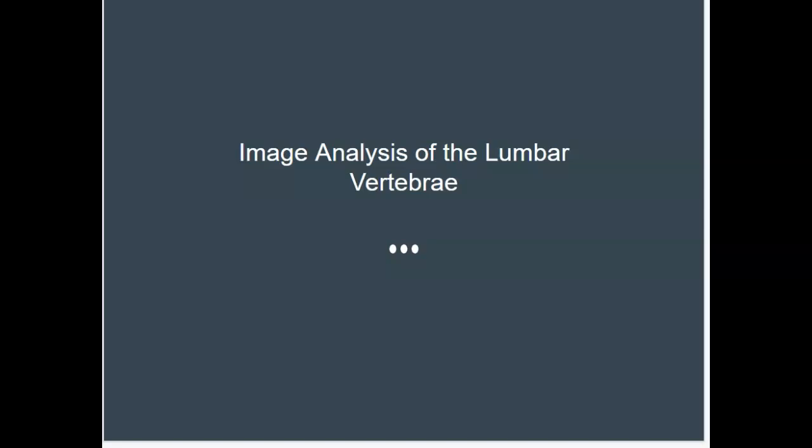Hello everyone. Today we will be talking about the image analysis for the lumbar spine. So let's get started.